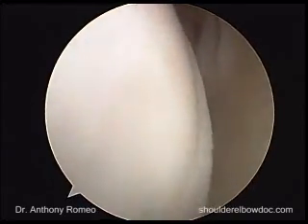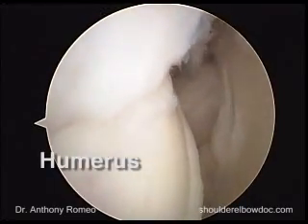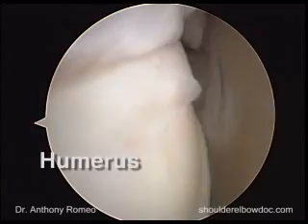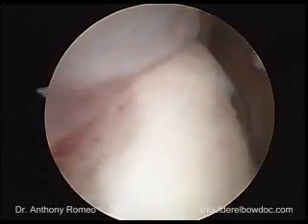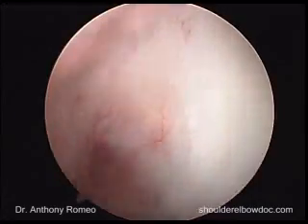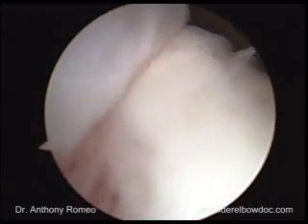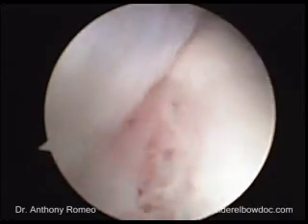We'll look over towards the humeral articulating surface. In the beach chair position, if we abduct and put a little traction on the arm, we can bring in the rotator cuff attachment and visualize this. Here is the bare area in the back of the humerus, and here's the top of the bare area, which is an important landmark we'll come back to when we get to the subacromial space.